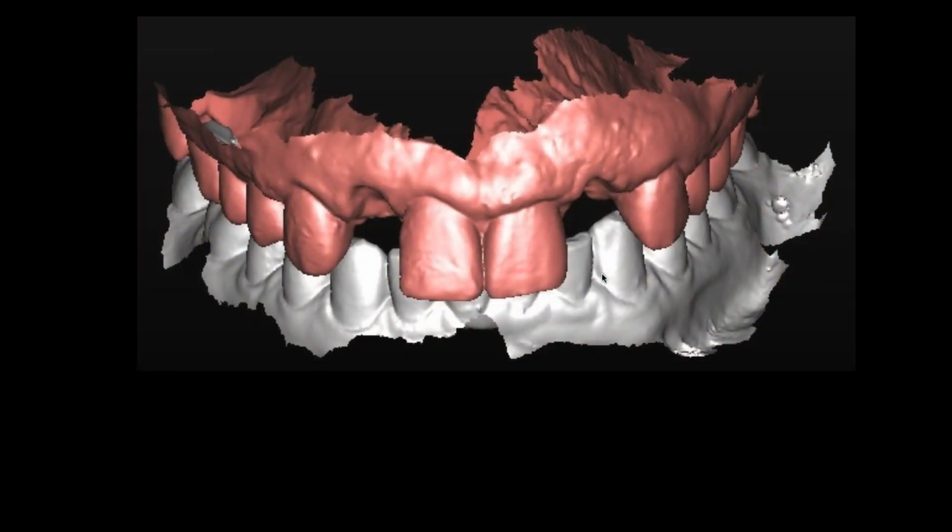I take my intraoral scanner, my Carestream 3600, and I scan the patient. Do it all the time. And I take that and I put it into my CT planning software, whichever one you want, but it works for both. But you can stitch any of these STL images into them. Now I got an occlusion.